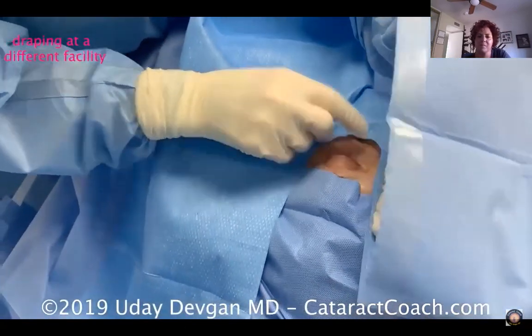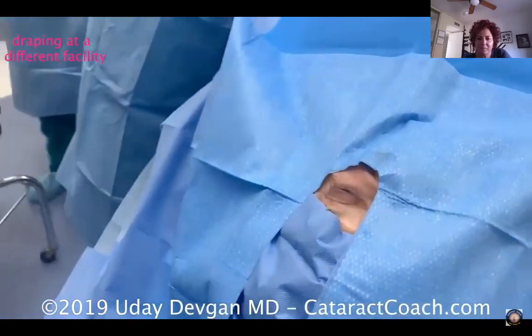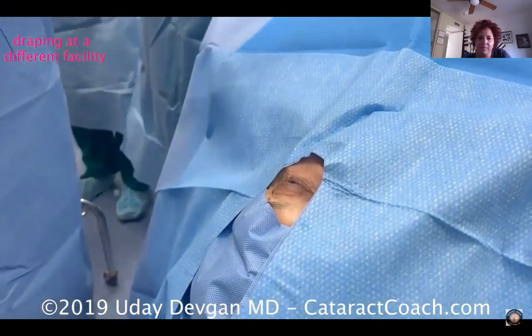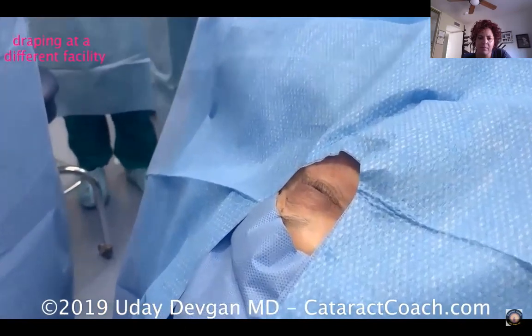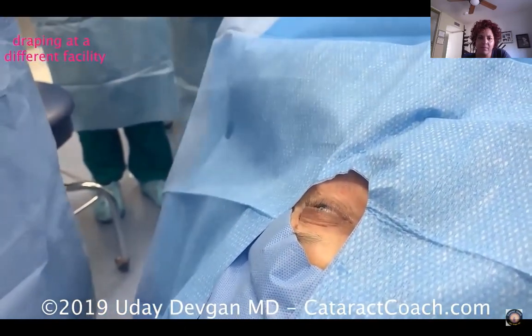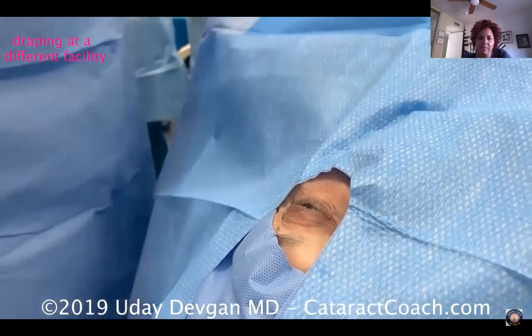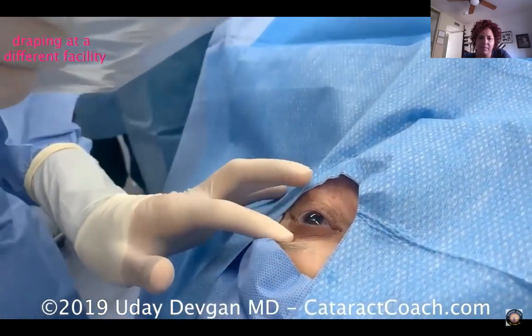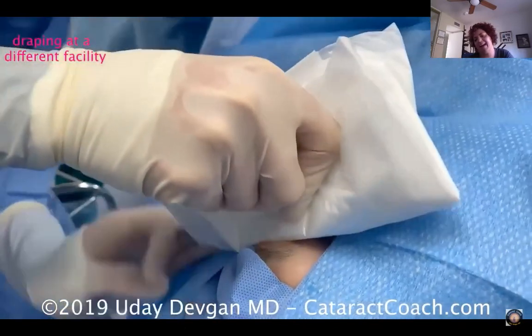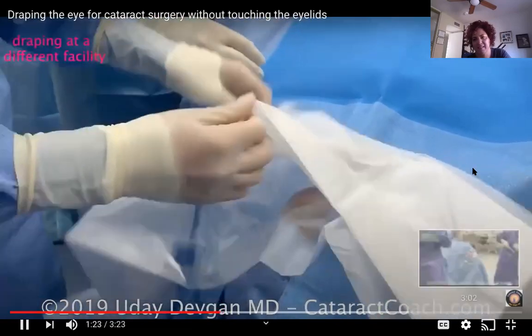Here it's being done in a different facility. This is not our Beverly Hills Center. It's not me doing this procedure. But I want to just show you a different technique. In this technique, the patient's eyes are again exposed, and the surgeon now is going to get a plastic drape. And when applying this, the skin has been prepped with povidone-iodine, betadine. He's going to use his actual fingers touching the eyelid, which has been cleaned with the betadine solution. Then he'll put the clear drape down and open up this drape.